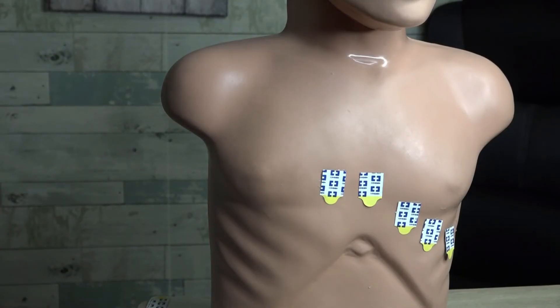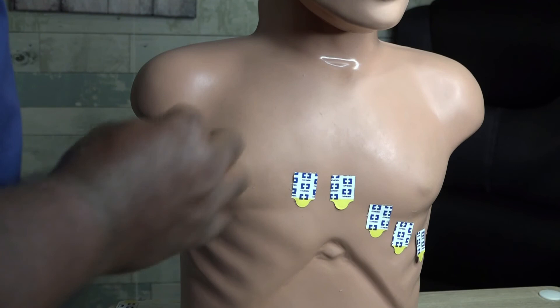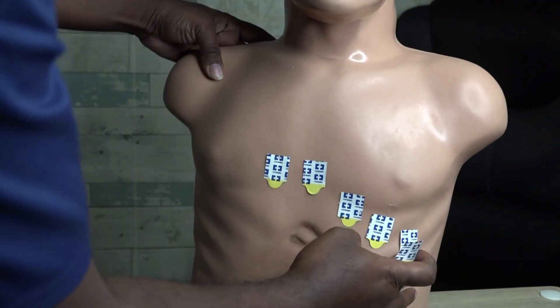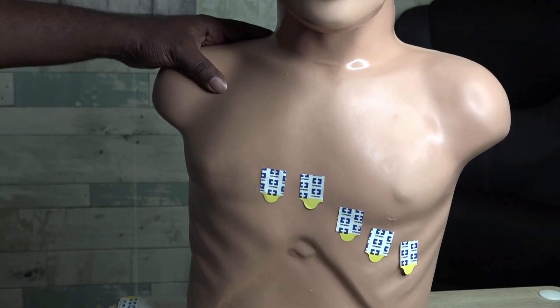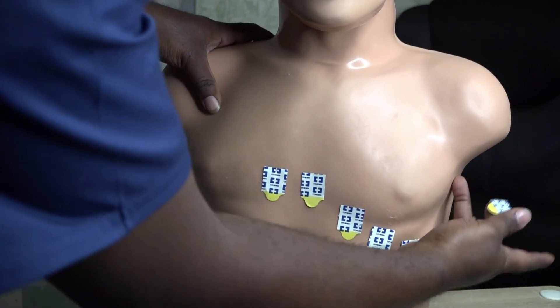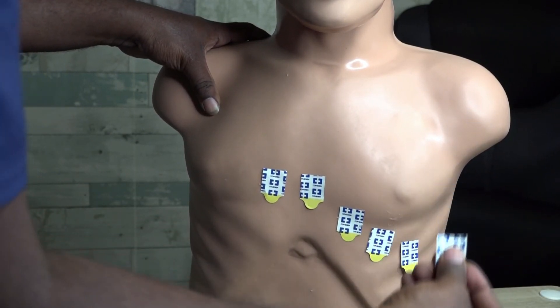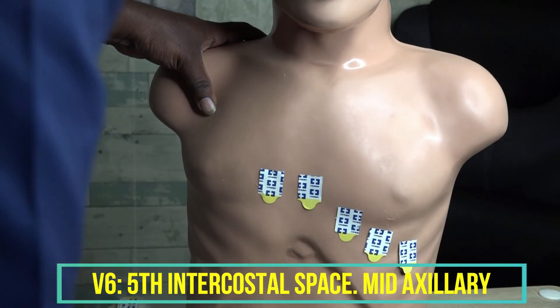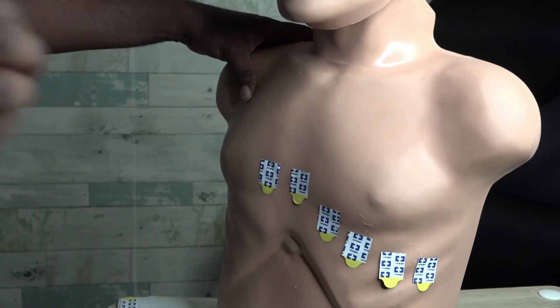Lastly, V6 is located in the fifth intercostal space. Instead of being at the anterior axillary line, V6 is at the mid-axillary line — at the same level as V4 — which is almost at the line going right up under the armpit. So V6 is at the fifth intercostal space at the mid-axillary line, same level as V4.